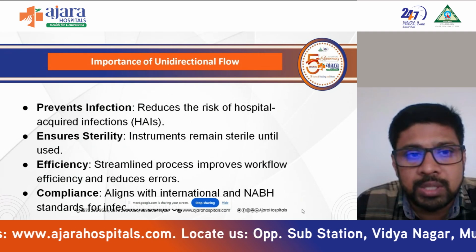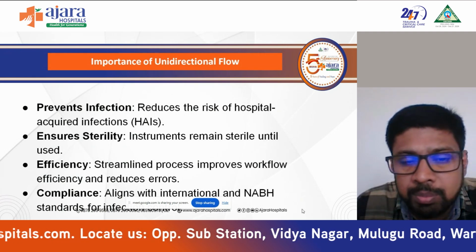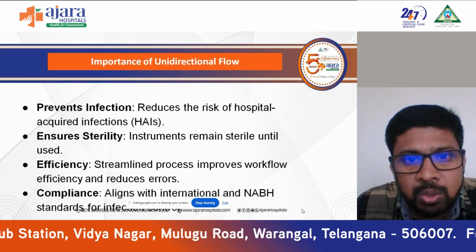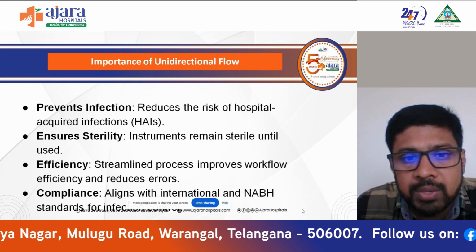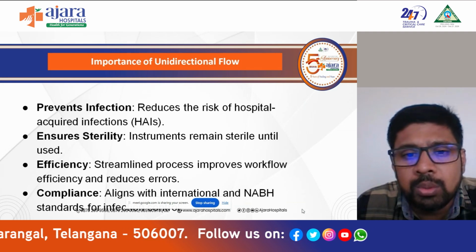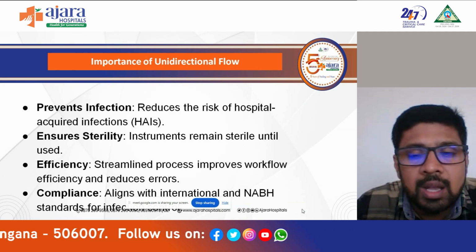Then what is the importance? We already discussed some points: to prevent infection. That is one of the main importances of the unidirectional flow. It reduces the risk of hospital-acquired infections the highest. Then it ensures sterility of the instruments. The instrument should remain sterile until use.